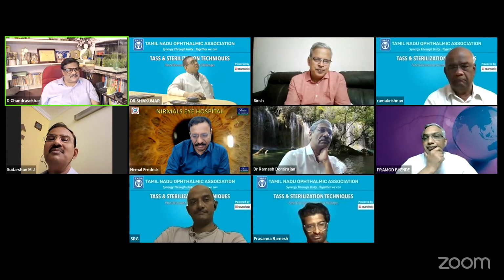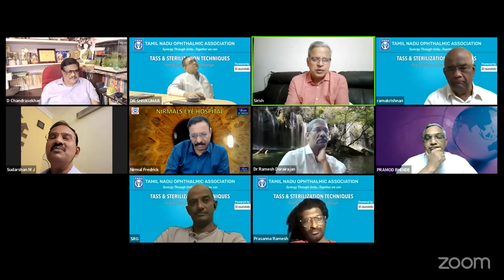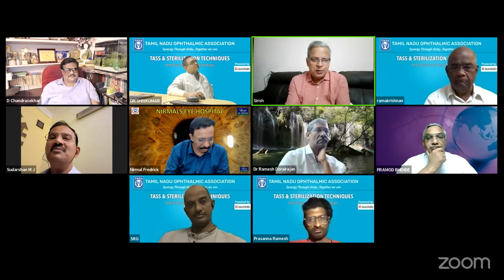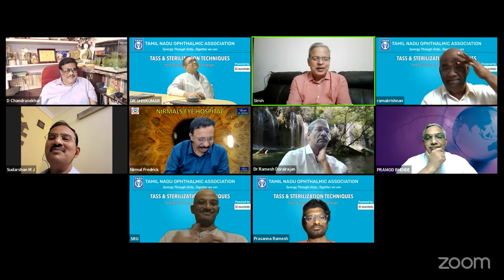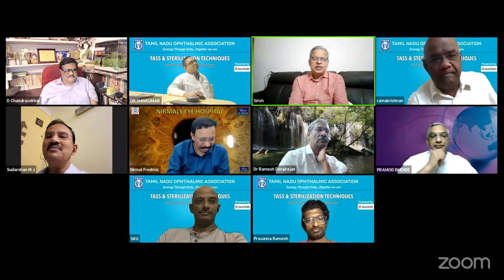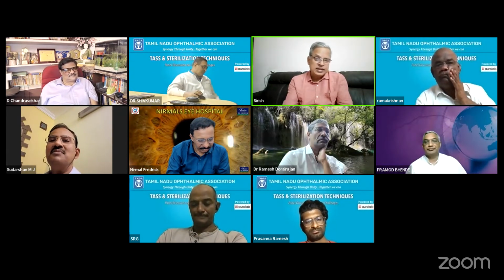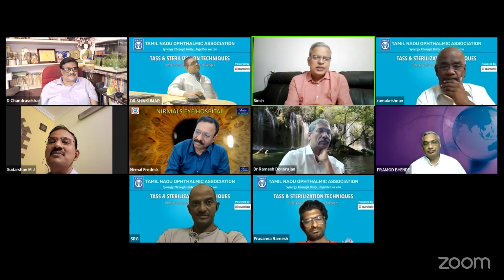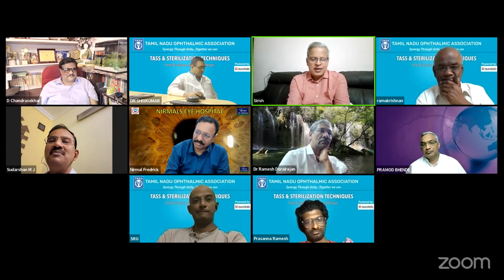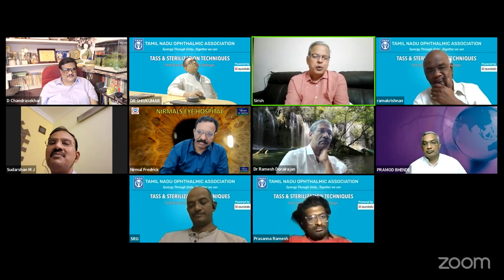What do you use for fumigation, sir? Fumigation, the quaternary ammonium compound. It is sold at about 2 liters for 2,000 rupees or 1 liter for 2,000 rupees, something like that. The name is very difficult to remember or pronounce. It's a very long name. Apart from that, what I use is only benzalkonium chloride in whichever commercial form it is available. Apart from this, there is nothing else that is used in my OT. But my OT cannot be the standard to be emulated. Mine is a smaller turnover OT. But if this is done, perhaps we would not be surprised far too often.